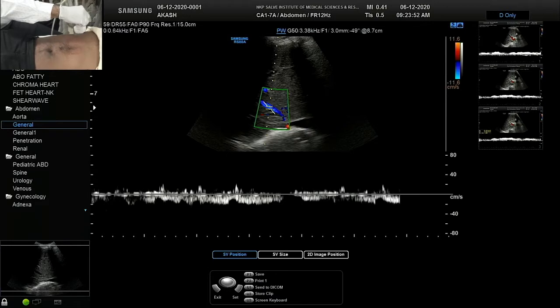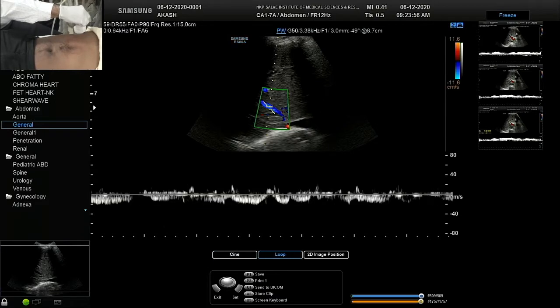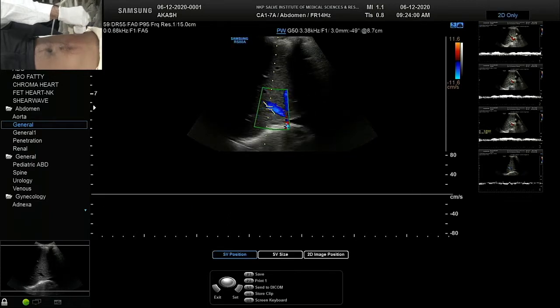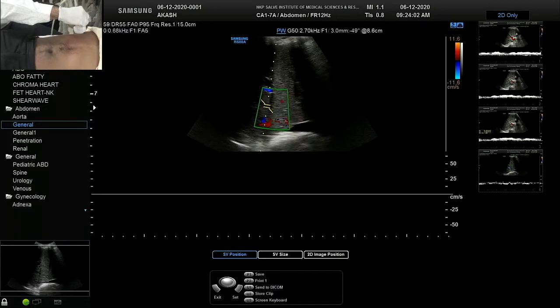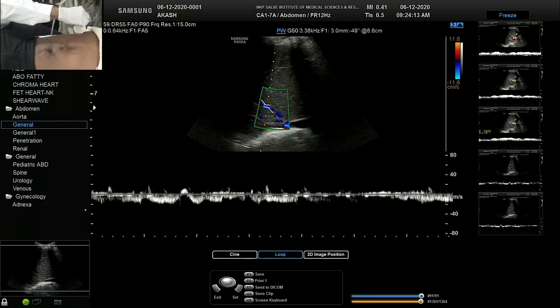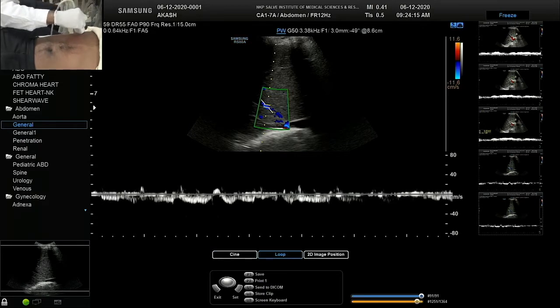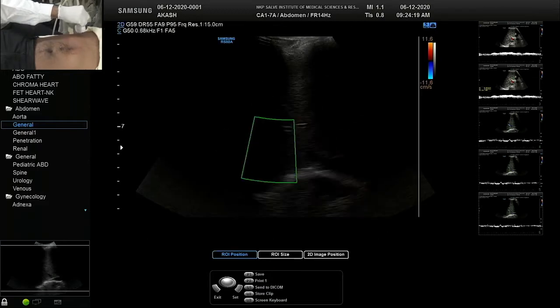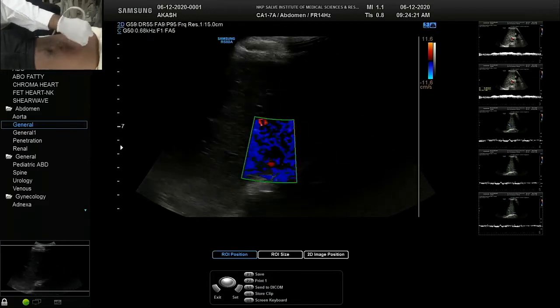You should sample it a little bit away from the confluence, so that the undulations of the IVC do not mix up with the hepatic vein. So though both waveforms will not be mixed, as the insertions of all hepatic veins are very close by, there can be disturbance. So we see here the typical triphasic waveform of a hepatic vein. So all good.